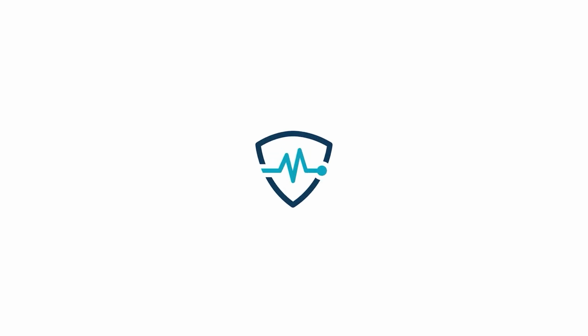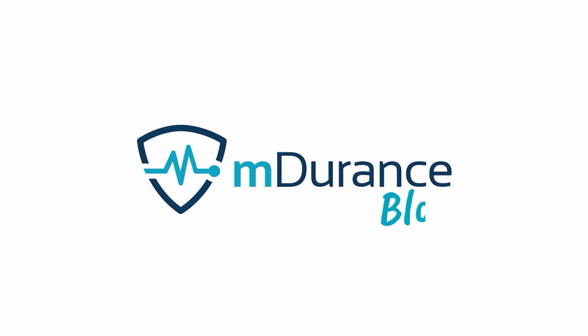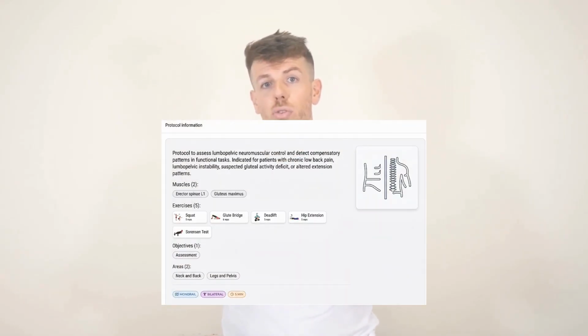They do a squat, a glute bridge, or a hip extension without anything seemingly strange happening. However, underneath that movement, there may be an altered neuromuscular pattern where the lumbar musculature is taking on work that should primarily be performed by the hip. And precisely to detect this, we can use mDurance's Lumbopelvic Dissociation Protocol, composed of 5 tests that allow us to analyze which muscle leads the movement, where compensations appear, and how control between the pelvis and spine is organized.